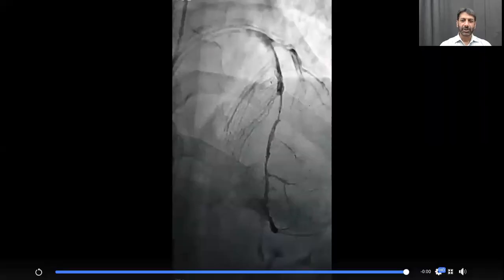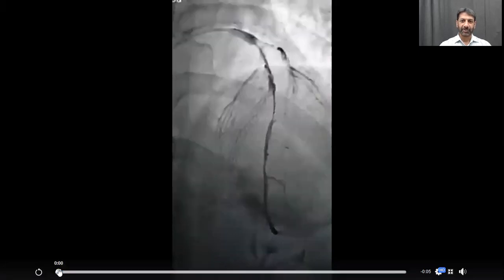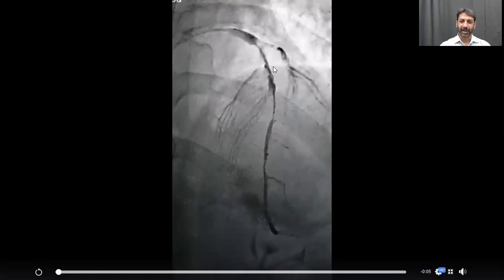So that was the clip, if you remember. Now there are a few things in this clip. If you see carefully, you'll find that there is something unusual here — this was the aspiration catheter in this clip. And if you carefully look at the film, the dye is given through this aspiration catheter.